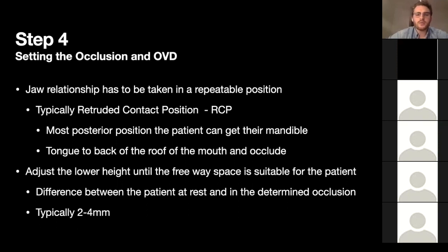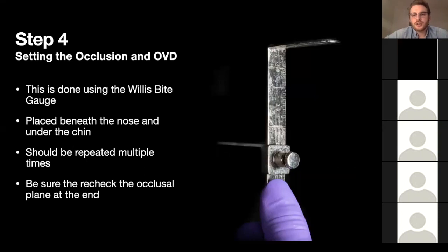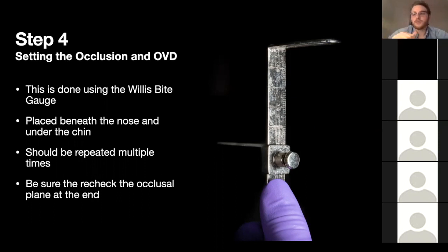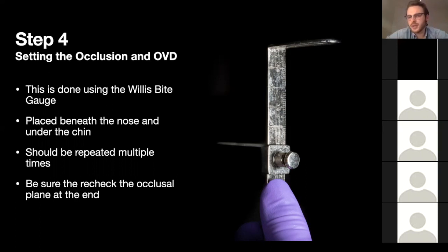To measure this I use the Willis bite gauge. You place the end under the nose and the part going backward sits under the chin, then slide the ruler to get the measurement. Get the patient into the OVD position, measure it, then let them relax and measure again — do it two or three times to confirm that freeway space. I also like to leave the patient in position for a few minutes and ask how it feels. Each time you've made an adjustment, go back and recheck the occlusal plane to ensure adding the lower rim hasn't introduced a cant.